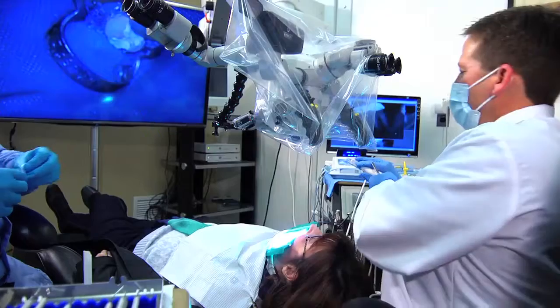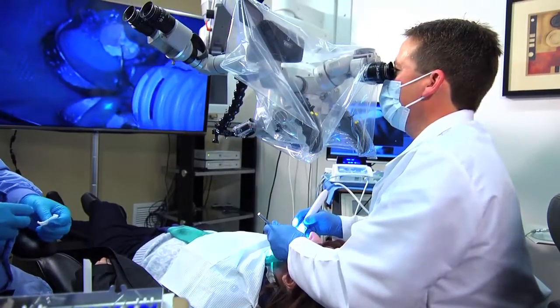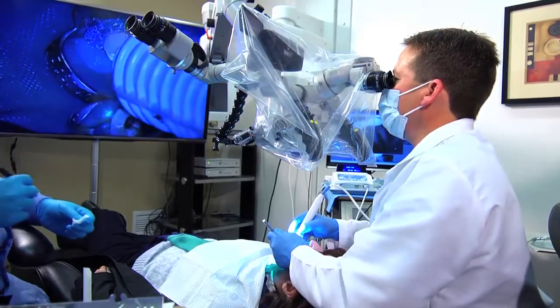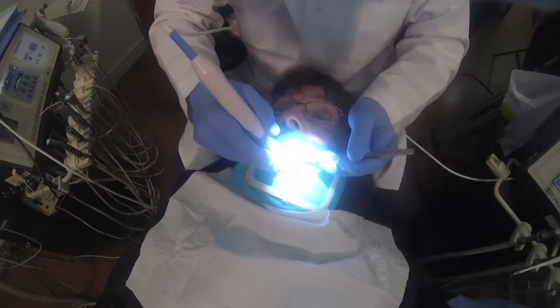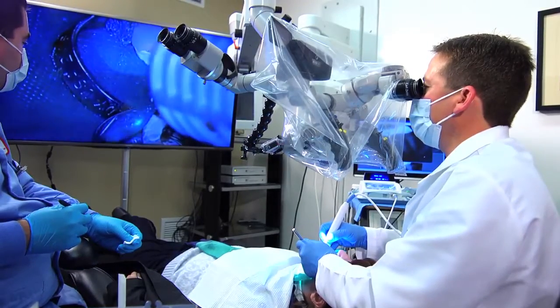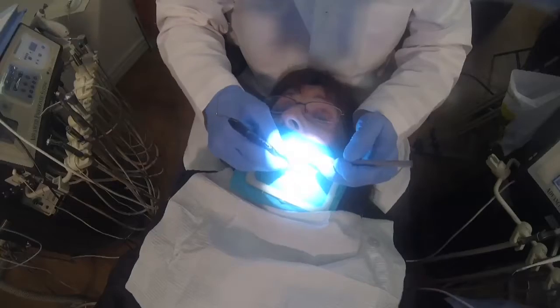So now I'm going to place my needle all the way down on the mass that I vertically compressed. The reason why you don't want to just place it down inside the canal and start squirting is because now the other mass is cooled down. This needle is making direct contact with the other gutta percha. Why? Because I want the two of them to heat up at the same rate. So now when I activate my needle, I don't have a cold weld. It now forces itself out at the same temperature.